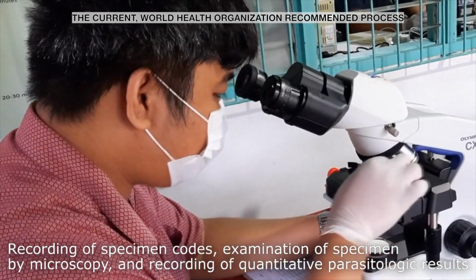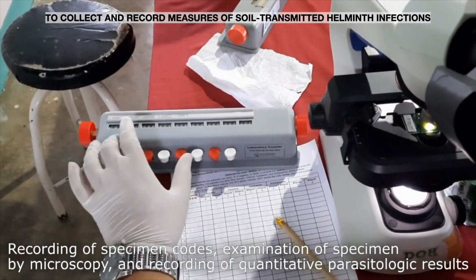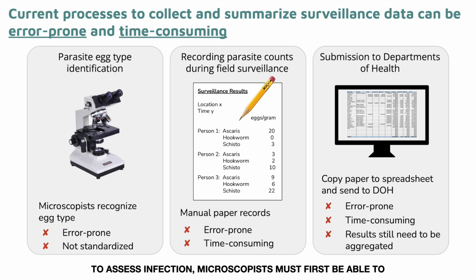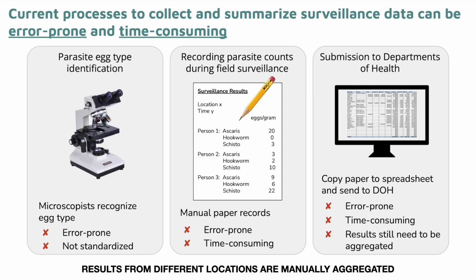The current World Health Organization recommended process to collect and record measures of soil-transmitted helminth infections or schistosomiasis is highly manual and subject to understandable human error. To assess infection, microscopists must first be able to accurately recognize the species of any eggs present in stool specimens. Next, results are recorded manually on paper, and they are later aggregated manually to share with different levels of the healthcare system, where again, results from different locations are manually aggregated. This process is error-prone and not timely.